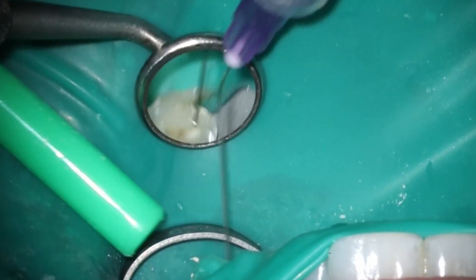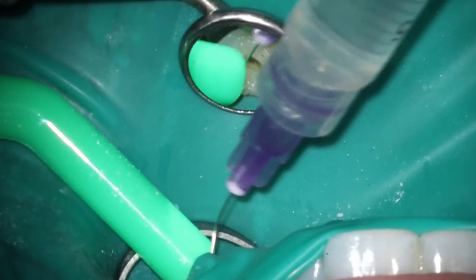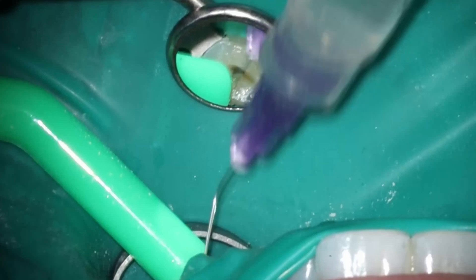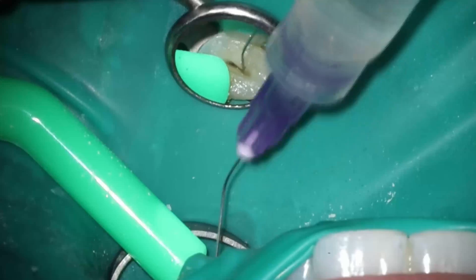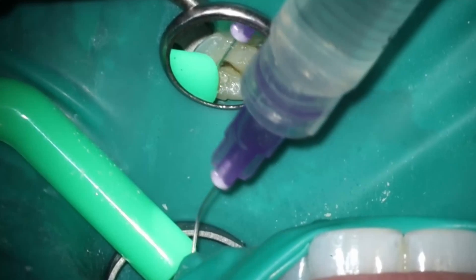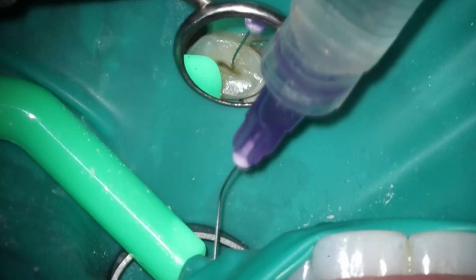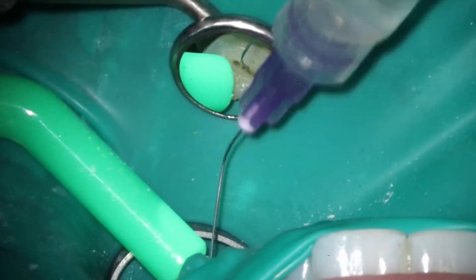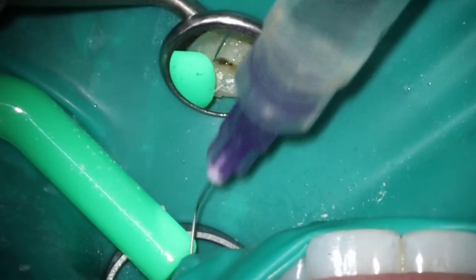We're just going to do the long rinse here, get all that out. Triton is a really nice material for this — I think it does dissolve better. The SEM research coming out shows it's wonderful for dissolving tissue and killing bacteria. I wish I didn't like it so much because it is a lot more expensive than regular bleach and EDTA, but what are you going to do? Doing the rinse here — this isn't sped up, it's just taking its time getting all the way to the bottom. I leave about half a CC so I can rinse out after I use the activator.